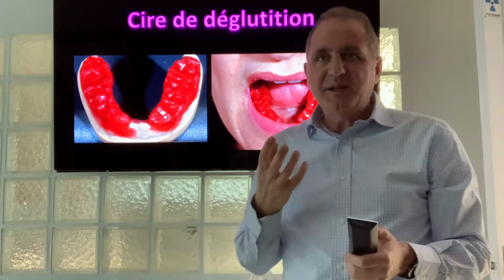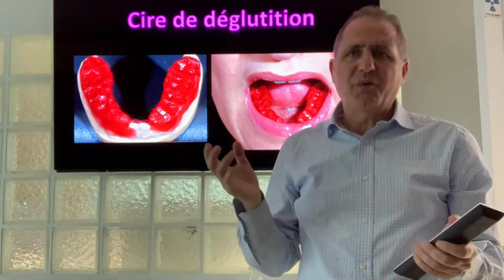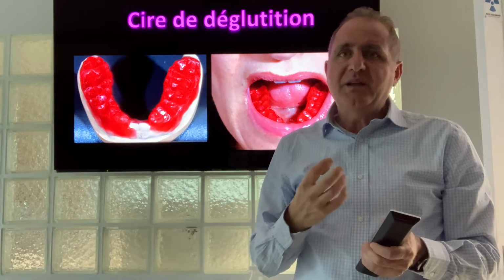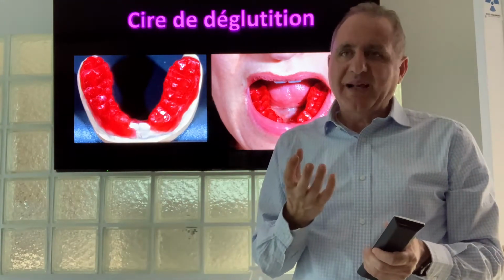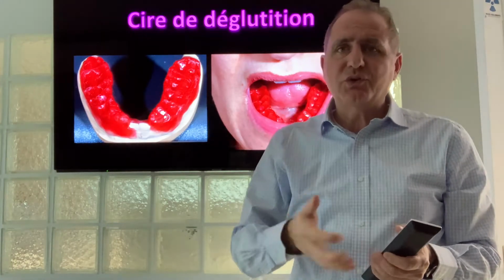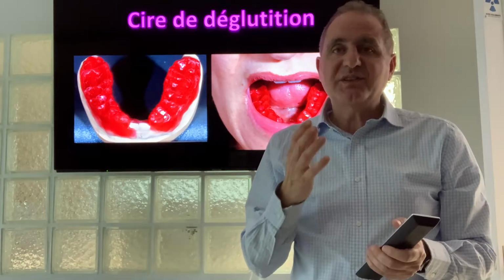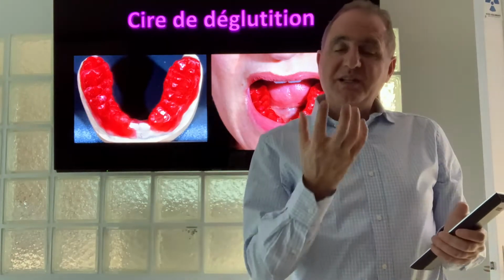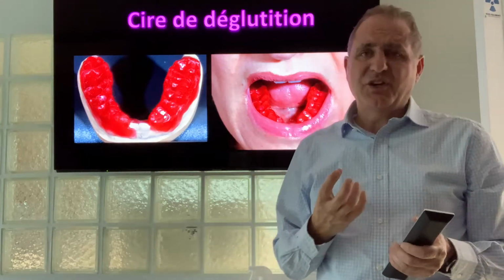So what is the method to do this? I don't know if it's a whole lecture for one day. I want to resume it quickly. So for me to find the situation, it's always the swallowing. Swallowing wax. This is a very tender wax that the patient will, for 15 minutes, drink water and swallow. And that's why, because we know that 2,500 times a day the patient will swallow and will position his lower jaw according to the upper. And this is very physiological.